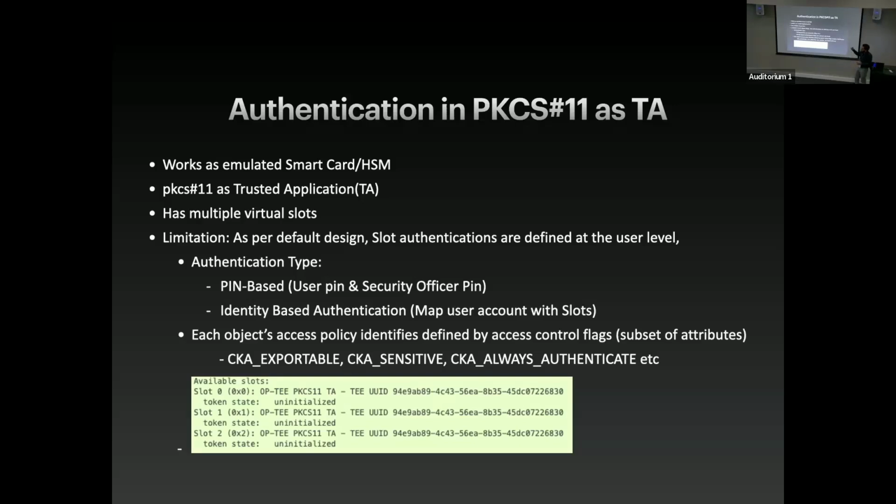So these slot authentications are defined at the user level. It means if you have an application running under some simple Unix or Linux user, all these applications will have access to this particular slot. It doesn't go any more granular than that. So that's the key limitation that developers should keep in mind while designing this solution. All the applications under the same account will have access to a particular slot.